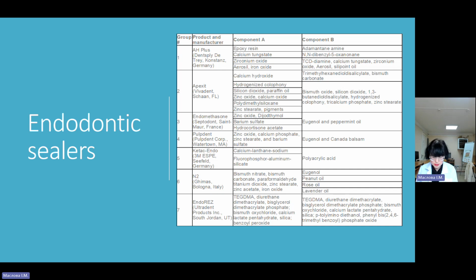Since gutta-percha soaked in eugenol showed an increase in volumetric expansion, the eugenol may exist in fresh mixes where it is not crystallized fully as zinc eugenolate. This combination of root-filling materials may counteract the shrinkage sustained by any sealer.